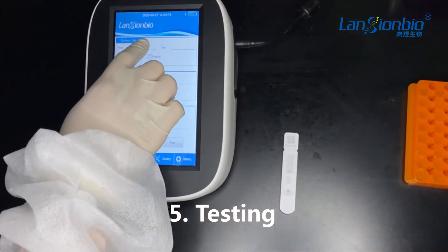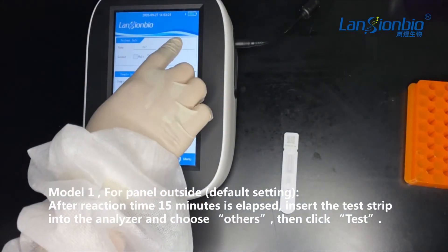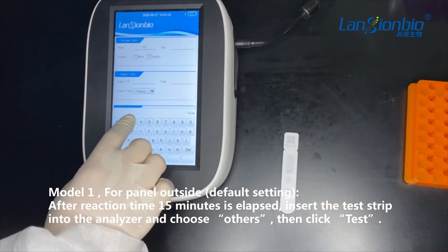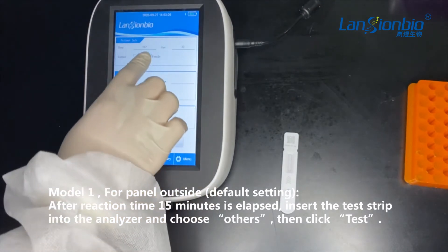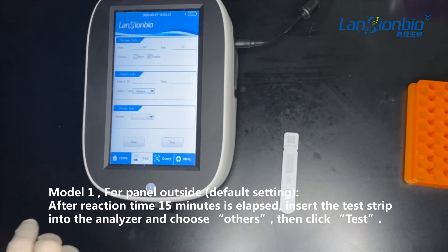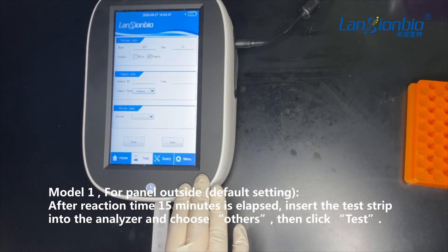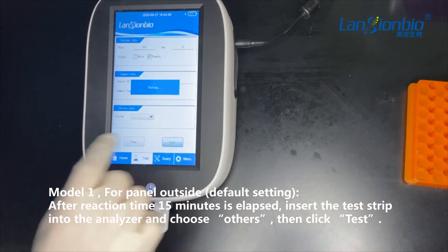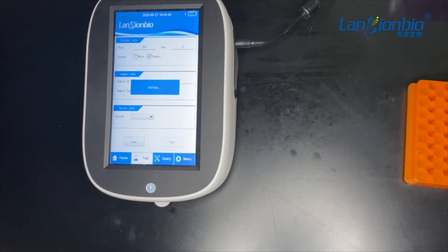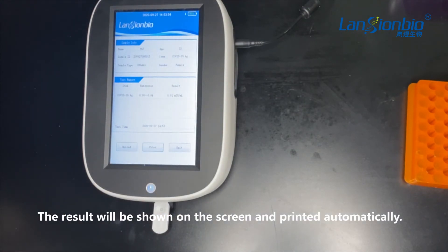Testing. Model 1, for panel outside. After the reaction time of 15 minutes has elapsed, insert the test strip into the analyzer and choose others, then click test. This model is supposed to be used when you have a massive specimen — it will work more efficiently. The result will be shown on the screen and printed automatically.